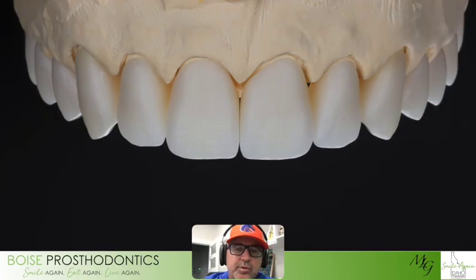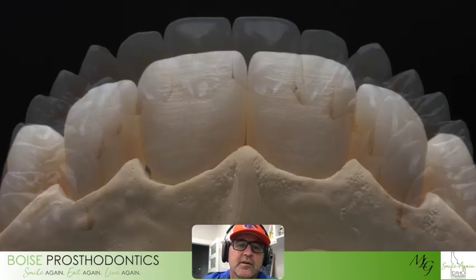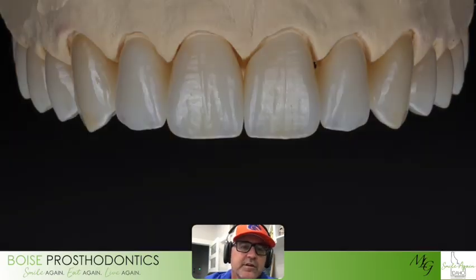And here's some beautiful pictures of how our lab technician will texture and prepare those crowns to make them look as real as possible. He just does an absolutely phenomenal job. This shows too the translucency of these materials to make them look lifelike, and then he'll finish them to put a surface texture on them that's very similar to natural teeth. I just can't explain enough how hard this is to do and how amazing our technicians are. Our main technician, his name is Dale Bischoff, super phenomenal.